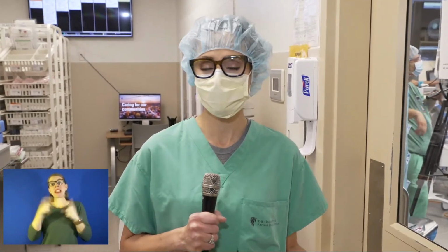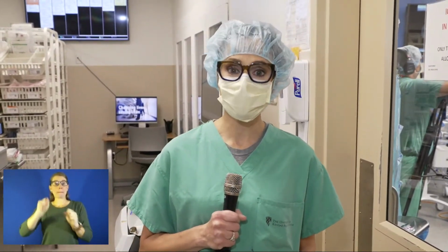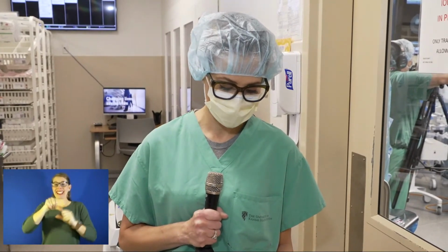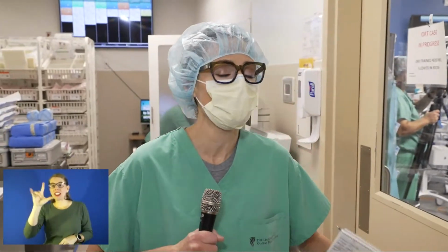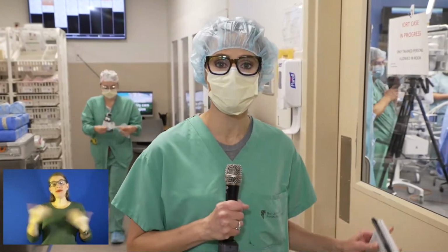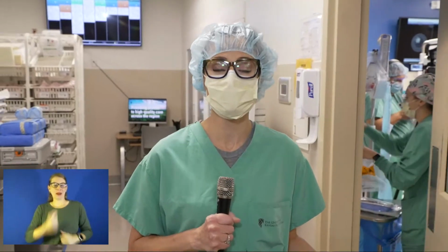In fact, speaking of the doctors who are in this room making this all happen, in order to make IORT therapy possible, it takes 9 highly trained specialists, and they include a surgeon, radiation oncologist, a physicist, a specialty trained scrub nurse, a circulating nurse, a CRNA, an anesthesiologist, a pathology PA, and pathology staff. So there are a lot of moving parts in here, but the whole purpose of this is to perform this cutting-edge procedure that will make it so much more possible for Leanna, our patient, to get back to life as she wants to live it once this is over.